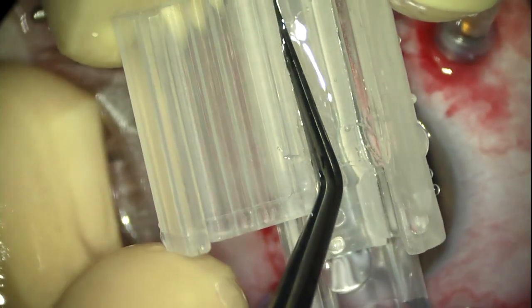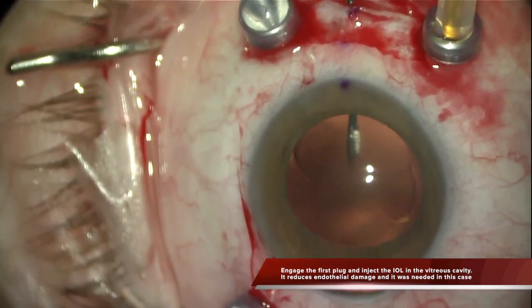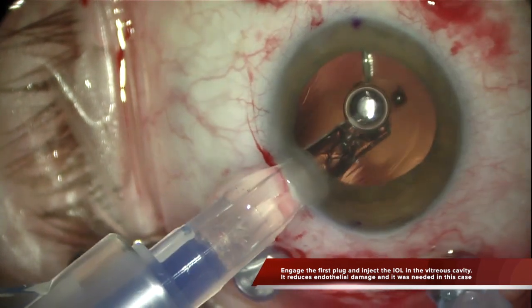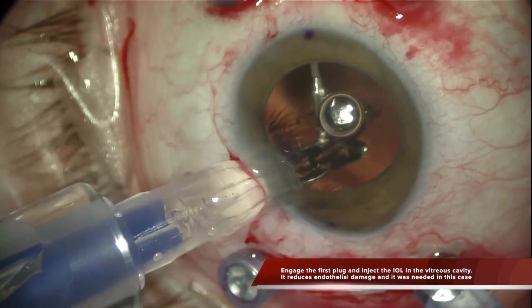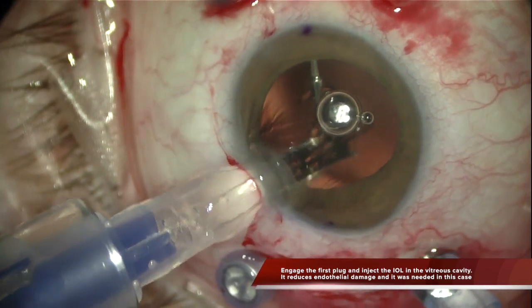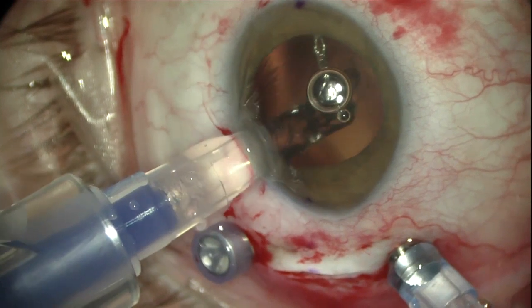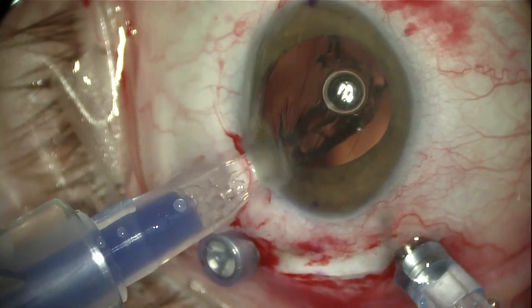In cases like this one with a very low endothelial count, I usually inject the IOL directly into the vitreous cavity instead of the anterior chamber to reduce the endothelial damage. So the injection technique is the same — turning the injector, grasping the first plug by the middle of the T-shaped external plug, and then injecting the IOL into the vitreous cavity completely instead of the anterior chamber to avoid any damage to the endothelium.